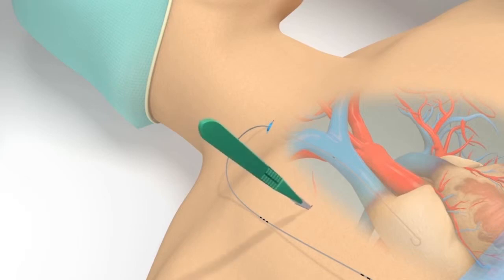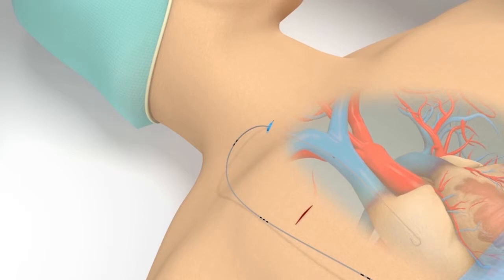Make a second incision parallel to the first at the exit site. Make the incision long enough to accommodate the cuff, approximately 1 centimeter. Blunt dissection may be used to create the subcutaneous tunnel starting at the exit site incision and working toward the venotomy site. This can ease the catheter's passage through the tunnel.